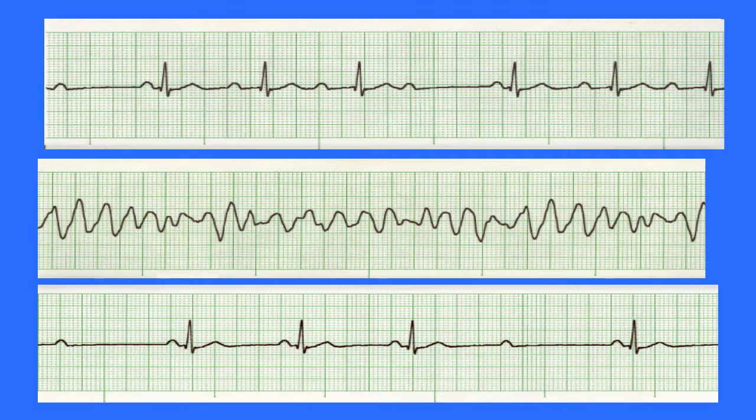The bottom one has a P wave to the far left, and then there's a P wave with a QRS complex, and another one, and another one, and then you have a P wave without a QRS complex, and that's a drop beat. In this case, different from the top one, you have a PR interval that's staying the same and not increasing, but you do have drop beats.